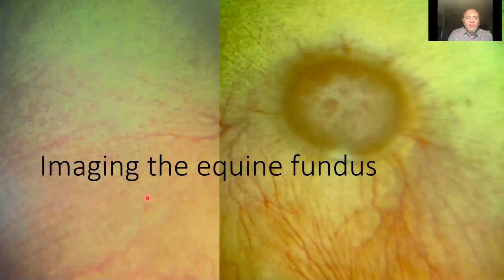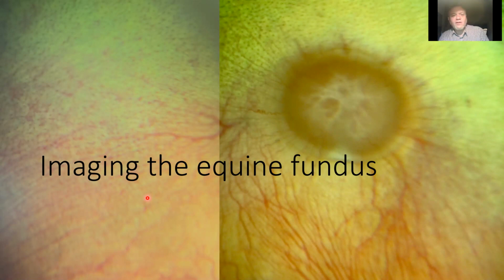We met this horse earlier. This is a horse with a total retinal detachment and a retinal tear. So again, we have to alter our views to examine the large intraocular area of this horse. So these are the sort of images we hope to be able to get when there's a clear visual axis and nothing impeding a view. This is a Cremello horse. Normal equine retina, one of my favourite equine fundus photographs.